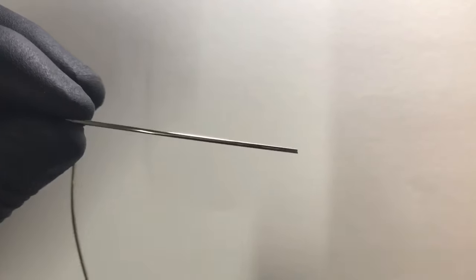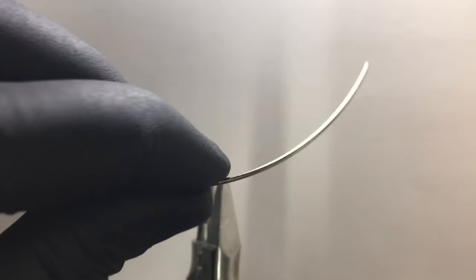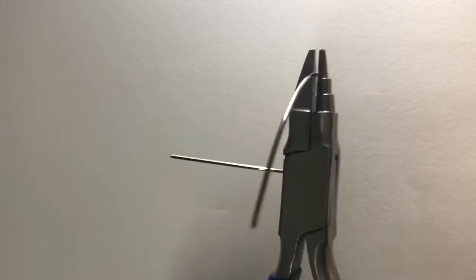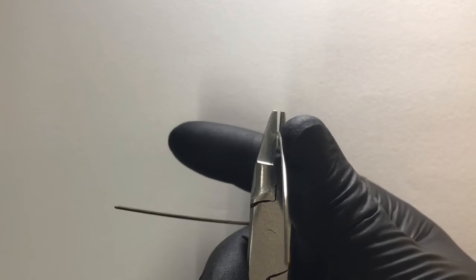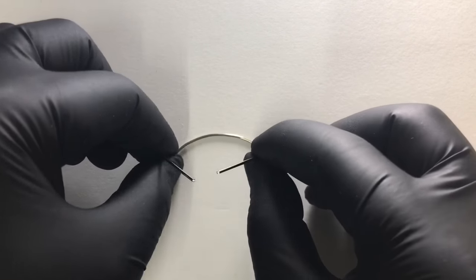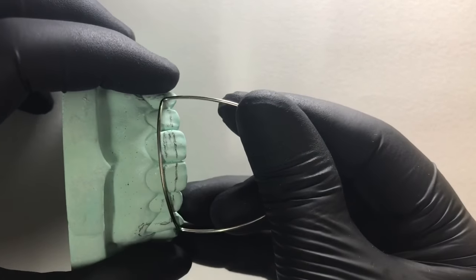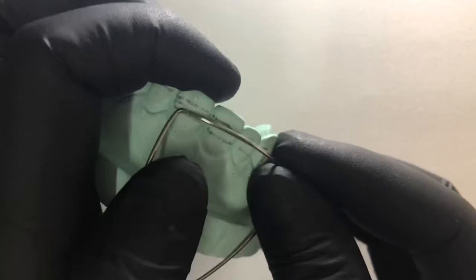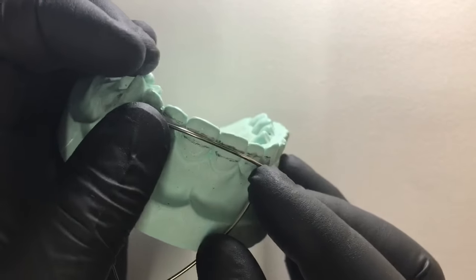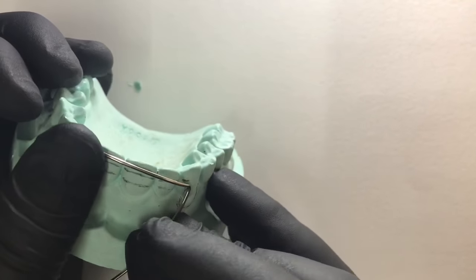Similarly at the opposite medial point that we have marked for the canine, we again give a 90-degree bend without distorting the plane of the component. Our extension is from the medial part of one canine to the medial part of the other canine.